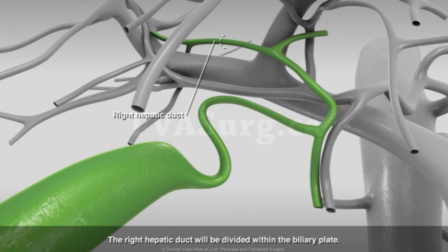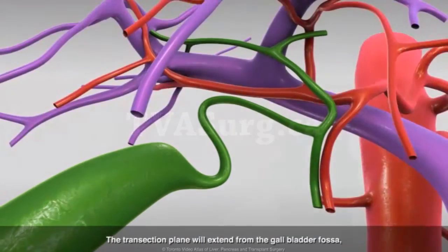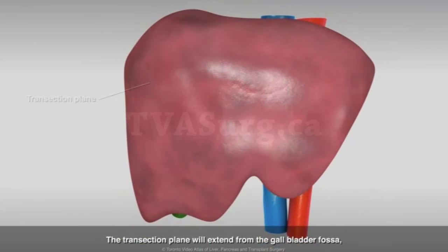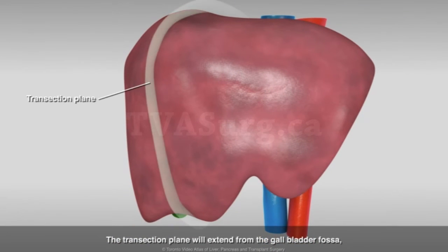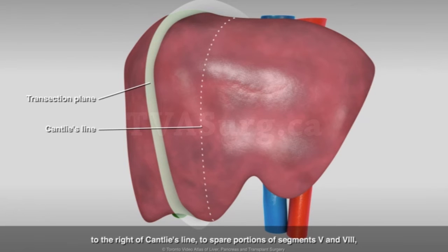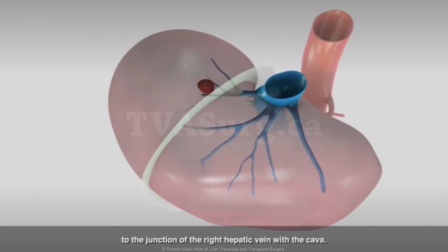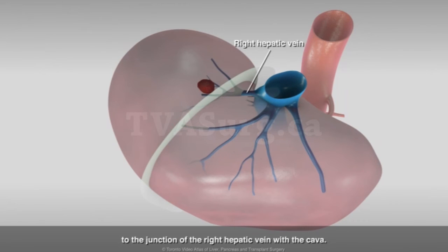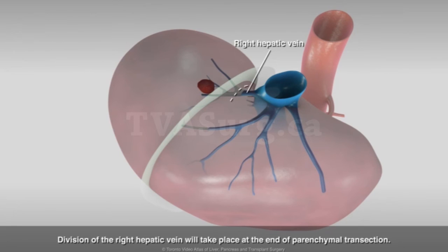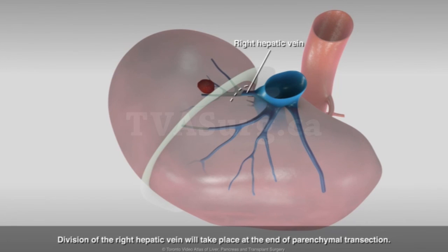The right hepatic duct will be divided within the biliary plate. The transection plane will extend from the gallbladder fossa to the right of Cantlie's line, to spare portions of segments 5 and 8, to the junction of the right hepatic vein with the cava. Division of the right hepatic vein will take place at the end of parenchymal transection.